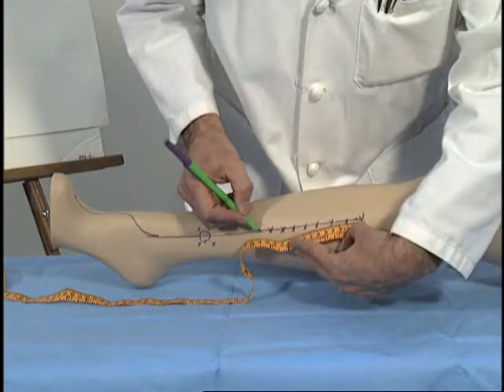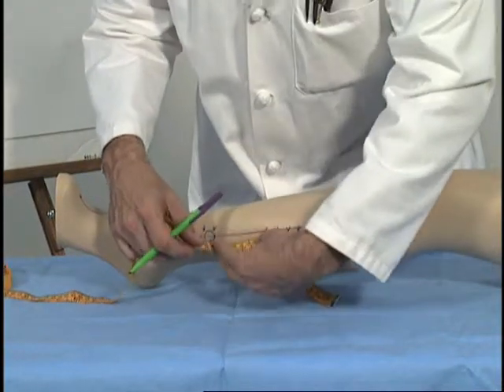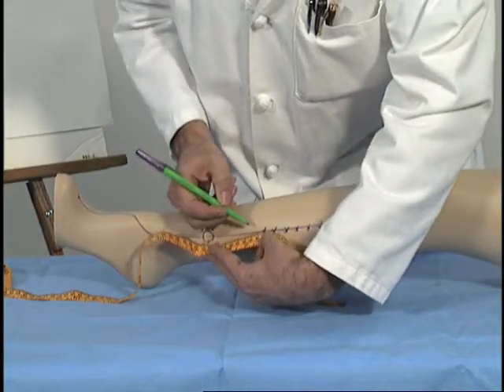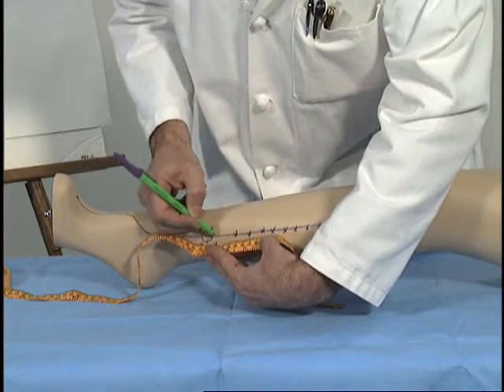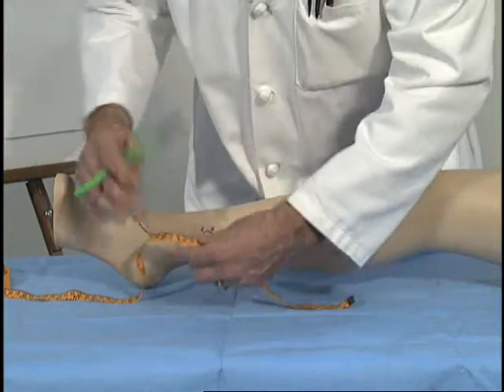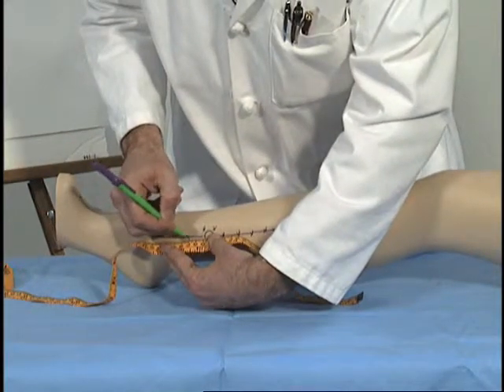In a case like this, where you ideally would like to be able to do more injections than you're allowed based on your constraint of 40, a little judgment is required to select the sites that you think are most important.